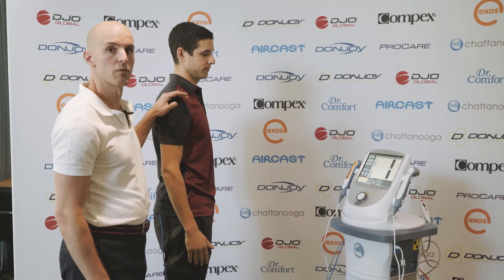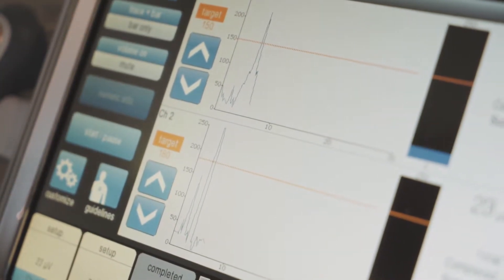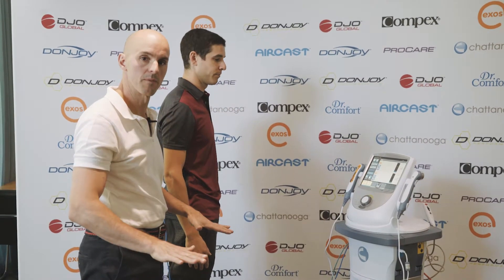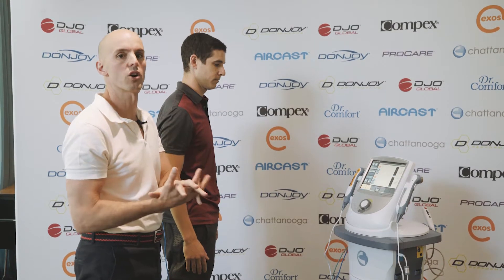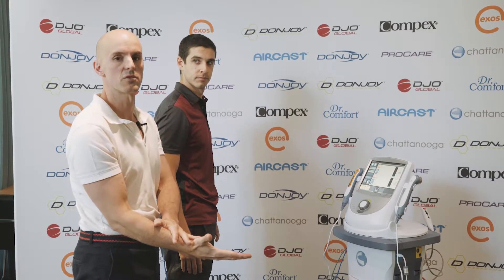So what we're getting here with Ryan is great spikes of activity as he drives out of the floor, but what we're not getting is enough activity on the way down. On the way down — that's what we call an eccentric contraction — and that's quite common in people. They've got good concentric strength, but they actually don't have the eccentric control we're after.